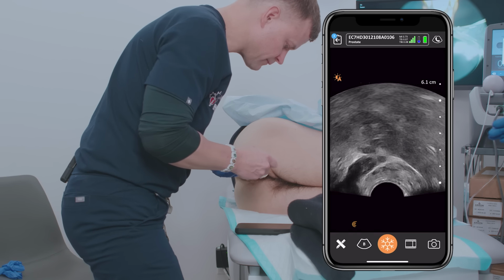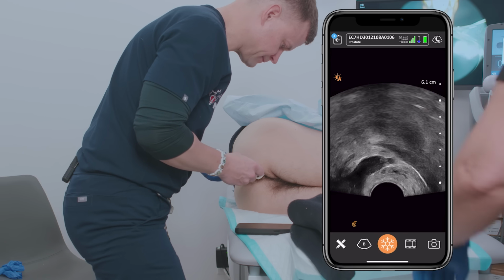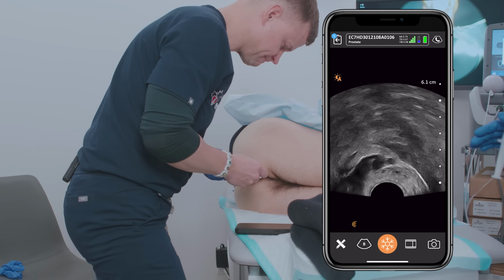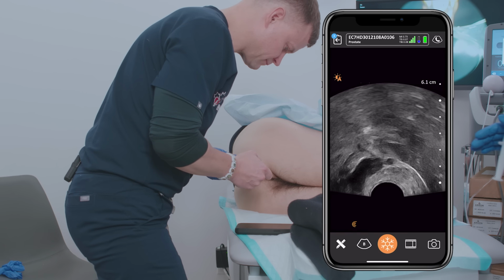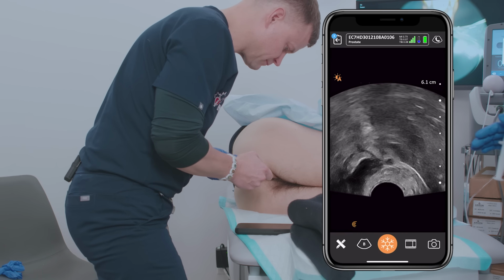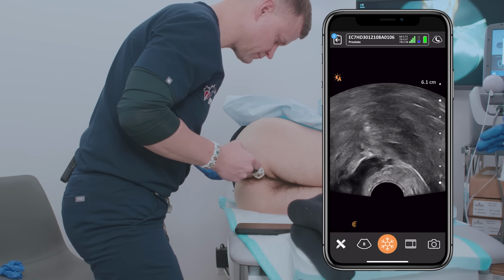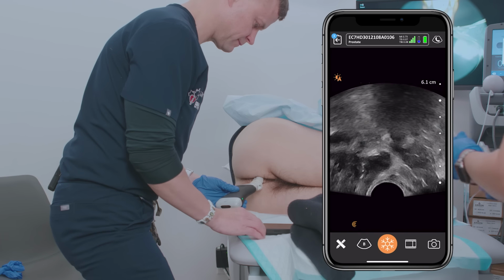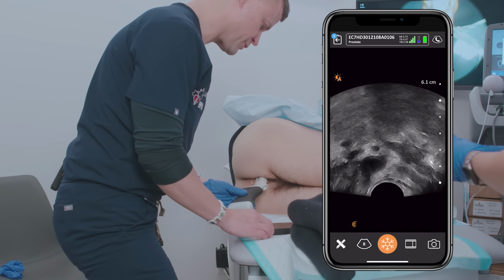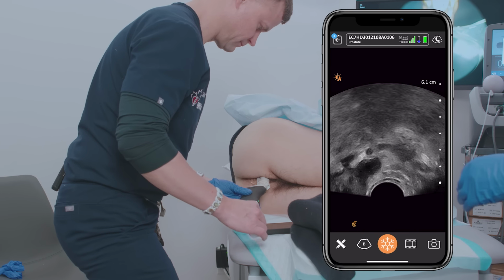Since we are doing a BPH procedure and wanting a deeper block, we will pass our needle through the seminal vesicle into the space above the clouds, as called by Dr. Bears, using the modified Bears technique, and injecting the lidocaine above the seminal vesicle, and then retracting back to the apex. So to get full neurovascular control with anesthesia, we will introduce the remaining 5 cc's at the apex.